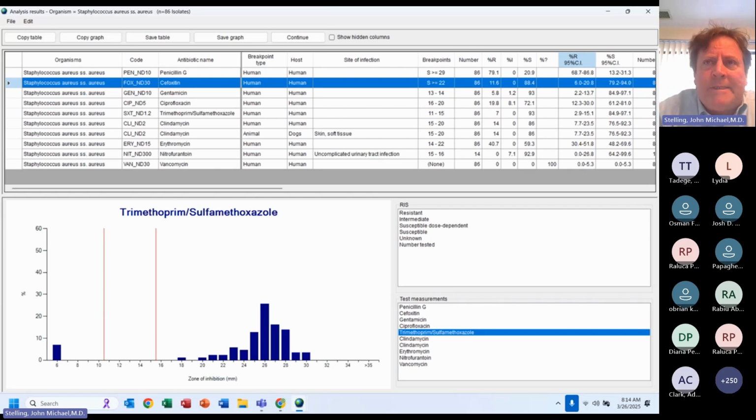So when the laboratory says susceptible, we are saying that this antibiotic is an appropriate treatment option, even if the bacteria is a little bit resistant. Especially with things like urinary tract infections, the antibiotic is often concentrated. So clinically susceptible means that the patient would probably get better, presuming the patient is not too sick already, and that it's an appropriate drug treatment choice. That means it's clinically susceptible.